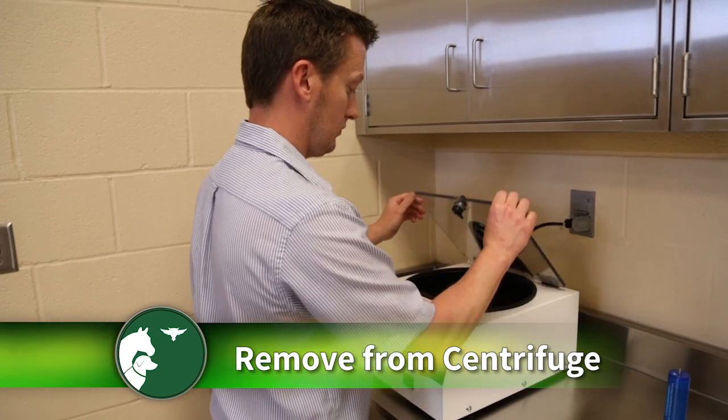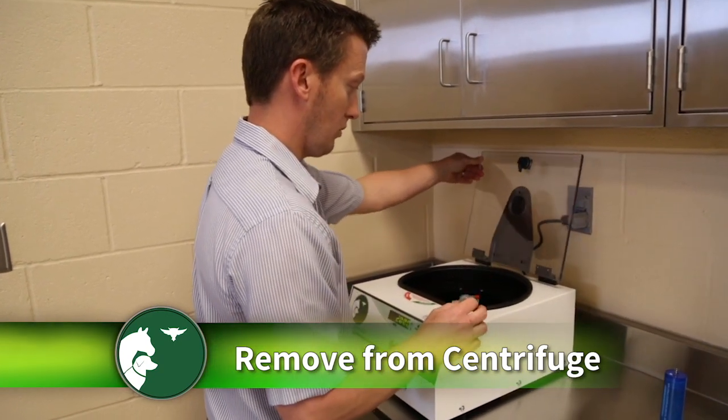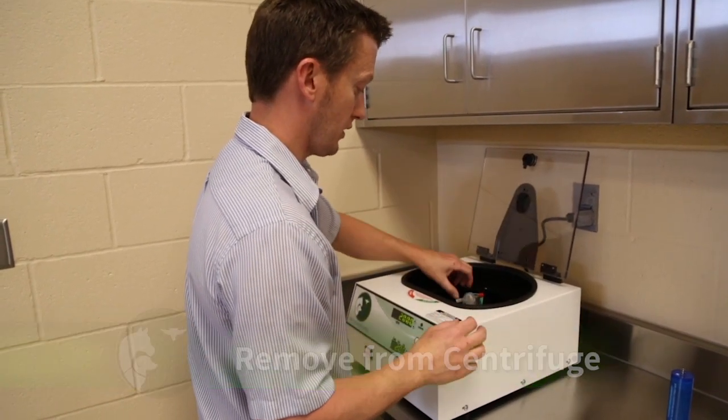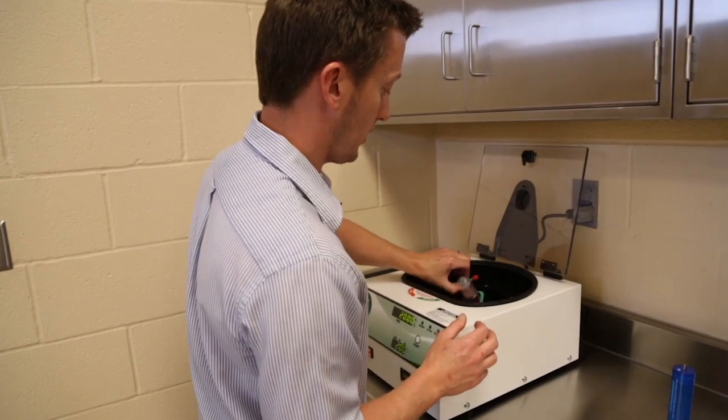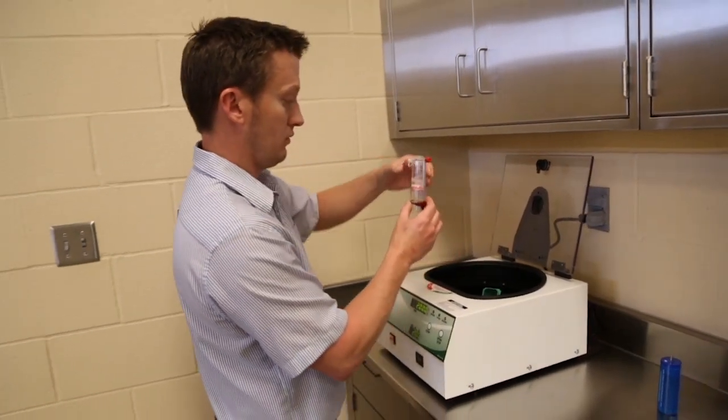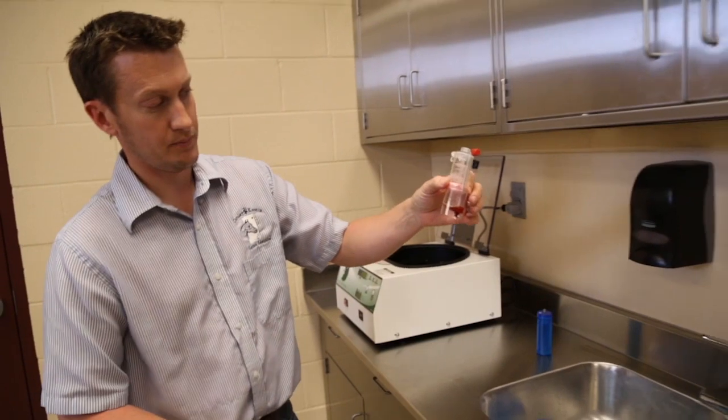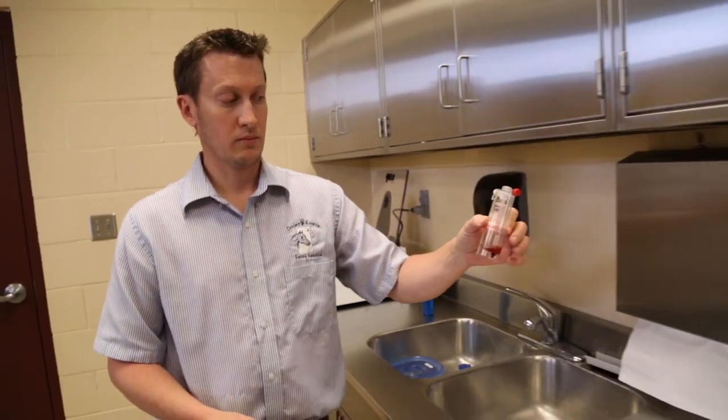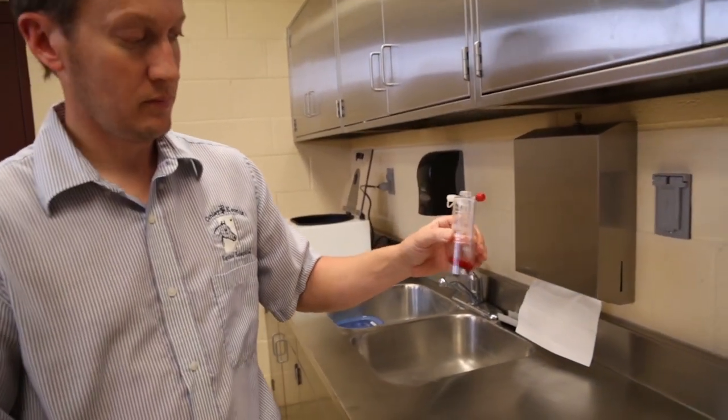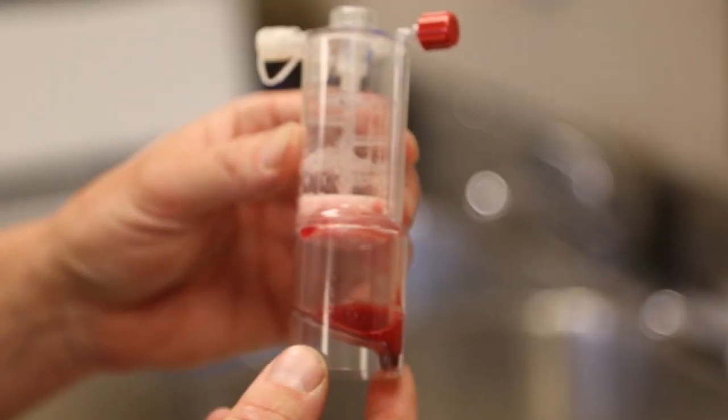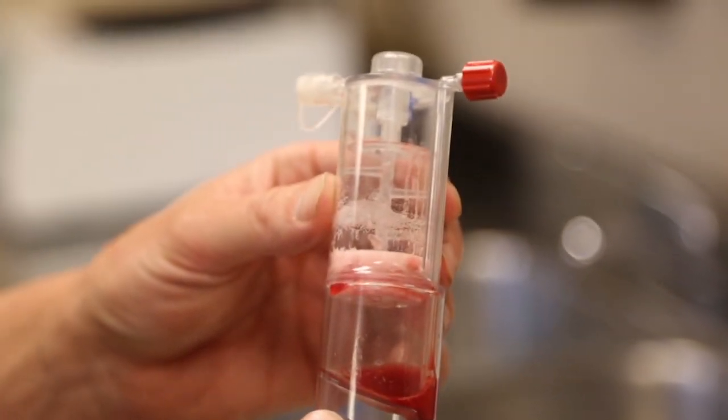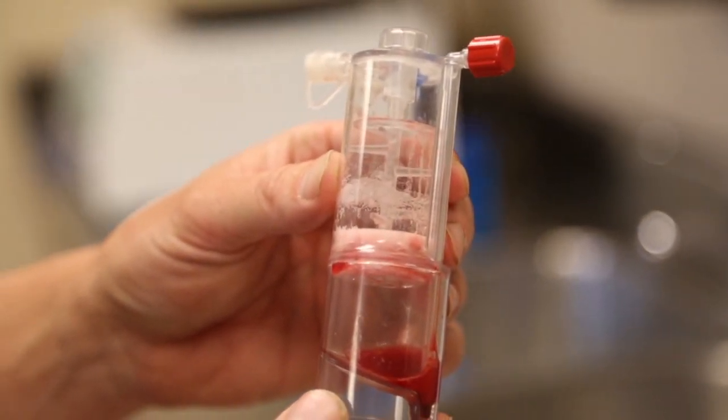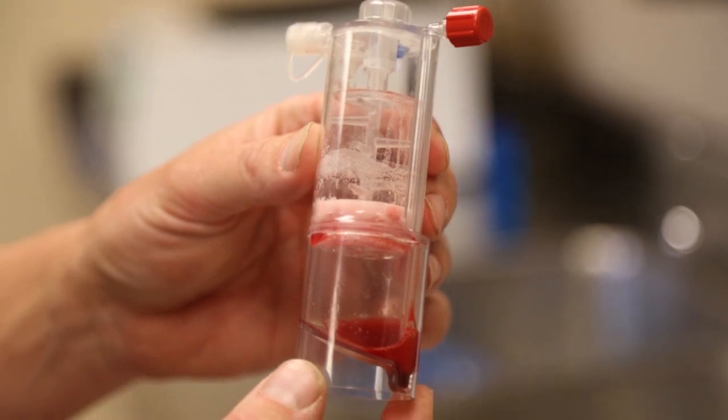At completion of the 2-minute spin, press the open button, open the top latch of the centrifuge, and remove the concentrator device. Prior to extraction from the concentrator device, gently shake before drawing into the final syringe. There will be a concentrated pellet of cells, so it is important to shake or agitate this concentration to allow for resuspension into the rest of the solution before drawing out for injection.